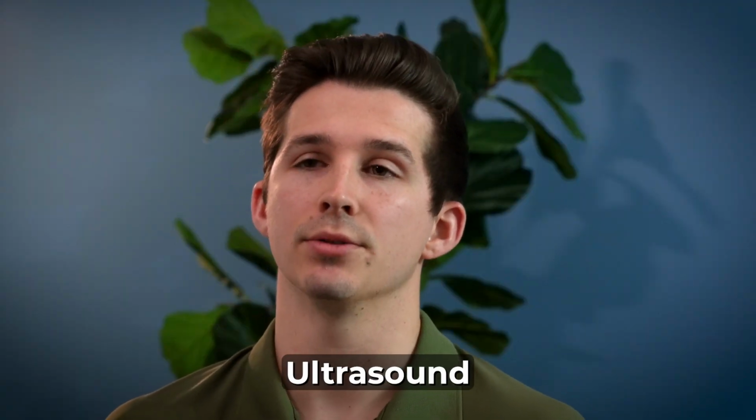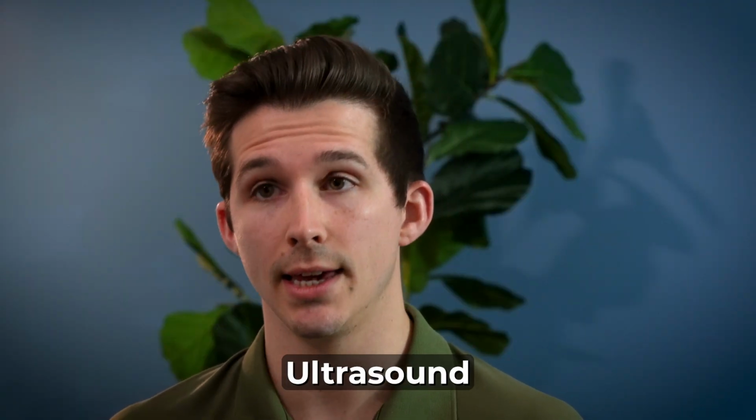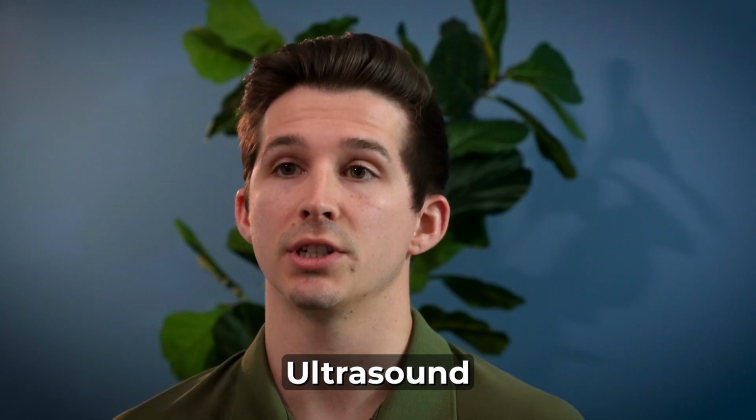Ultrasound is unique in that it uses sound waves that are then converted to heat at the site of the tissue to stimulate muscle healing as well as blood flow to the area. And there are two types of ultrasound use. One is thermal and the other is non-thermal.